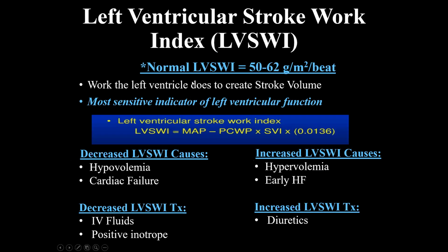And this is the only parameter, and it's a calculated parameter, and honest to God, please don't study this one either. It tells me how well the left ventricle is contracting. So we 100% want to know this. If I didn't have an echo for whatever reason, it tells me how well the left ventricle is functioning. So it's a very important parameter. The left ventricular stroke work index tells me how well the heart's contracting.